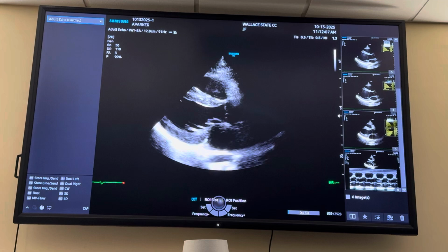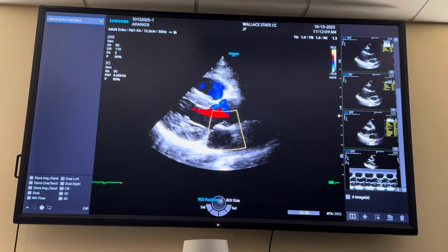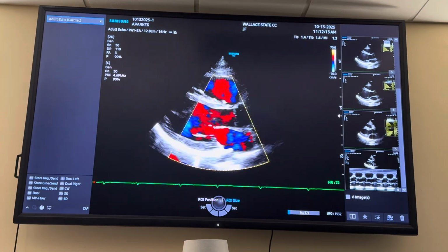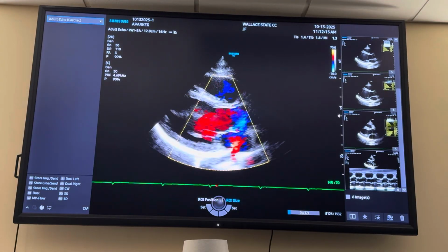And don't put one big color box across the whole heart. If you start forgetting stuff, if I see a color box across the whole heart, I'm like, they don't know what they did. Yeah, because you don't know where you're focusing.